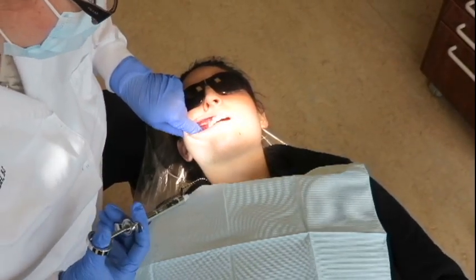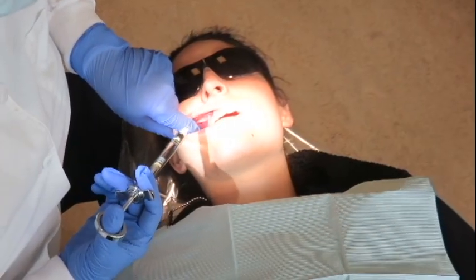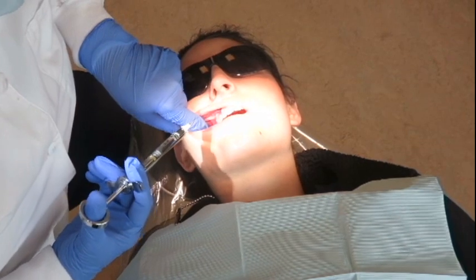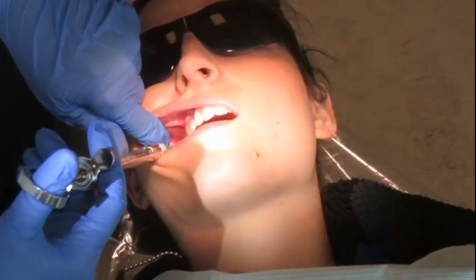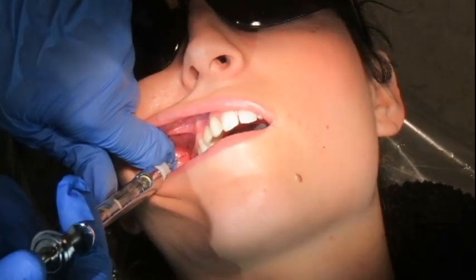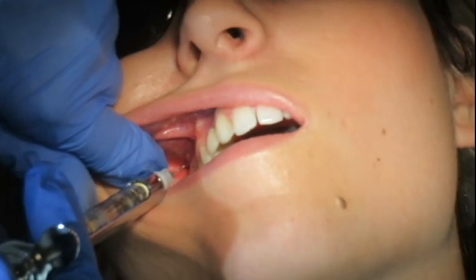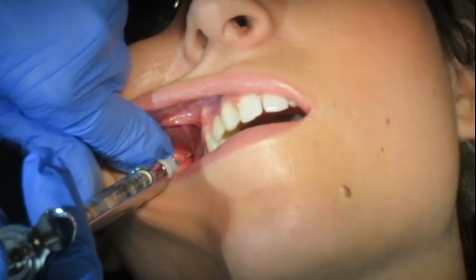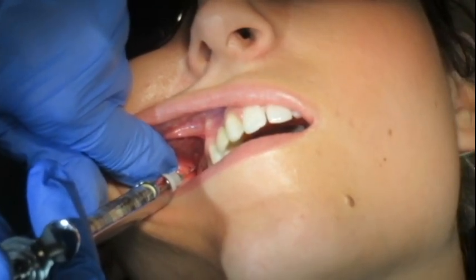As you're going in, you're going to find that 45 degrees to the sagittal plane and 45 degrees to the occlusal plane — so you're down and out. My elbow is tucked in close to my body, my palm is up. I go in and then adjust my angles. I'm pulling towards my tummy a little bit to stretch the lip and get the right angle. I'm going to do minimum penetration, aspirate — it's negative — so I give a couple drops and wait five seconds. You really have to maintain pressure on that lip and pull towards yourself to maintain that angle; it's really easy to lose.